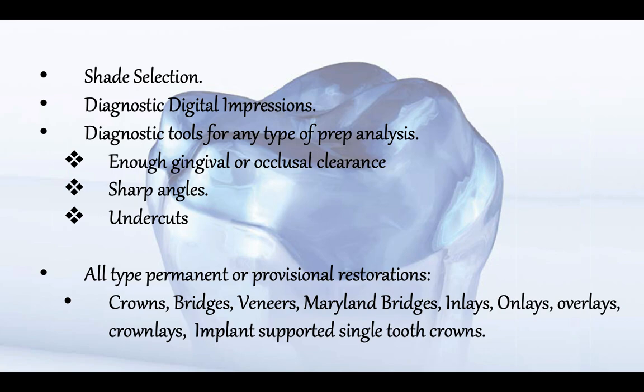Besides that, you also can use those systems for shade selection, which, I would say, the best is the human eye, but in case you want to try, you can do the shade selection in any of these systems.